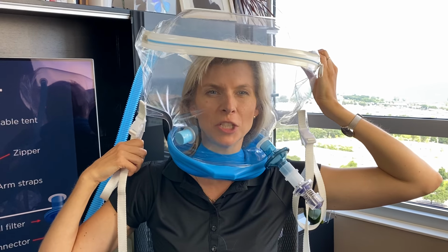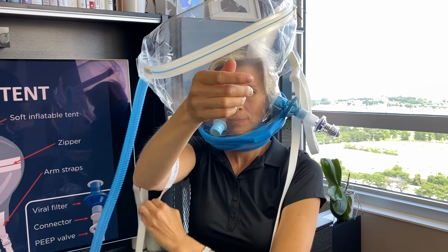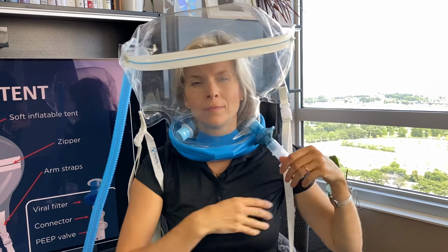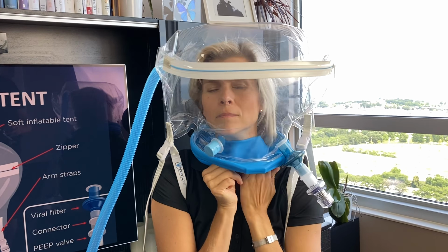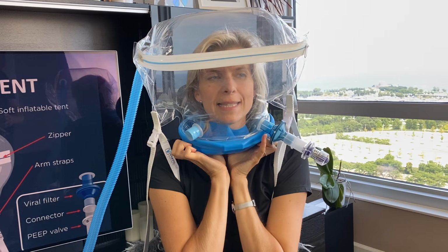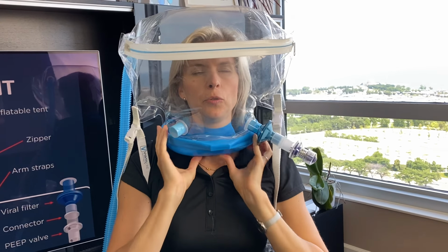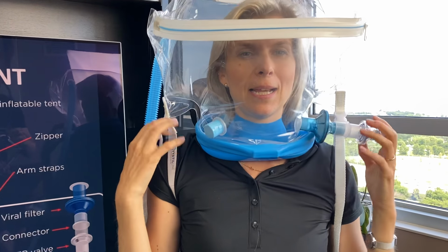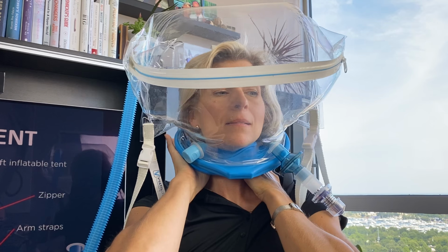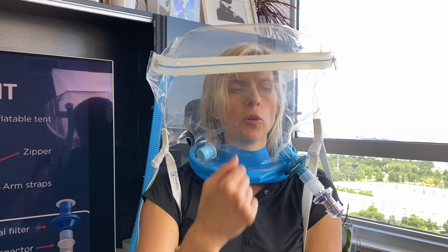Okay? So if you have any issues with the neck seal, you want to make sure that you adjust the arm straps. Again, you want to make sure the neck seal is comfortable, okay? It's not too tight. If it's too tight, you take scissors and you cut it based on the patient's neck, okay? So I'm just going to make sure there is no air leak, nothing is obstructing the neck seal, okay? You make sure you adjust the arm straps so there is no air leak.